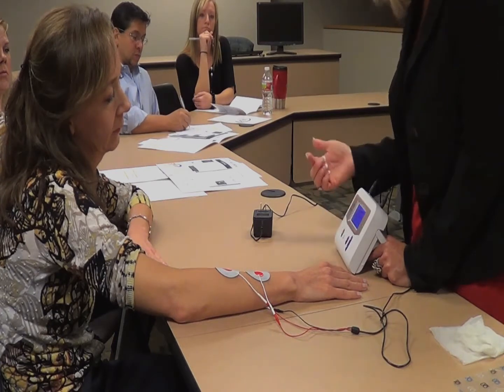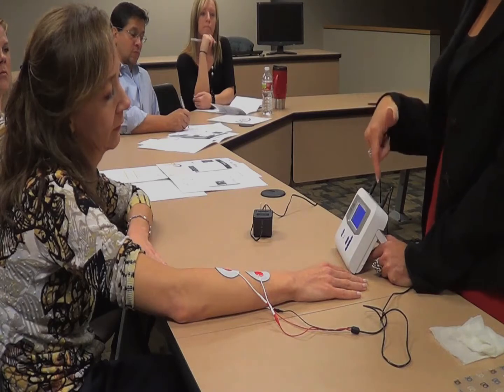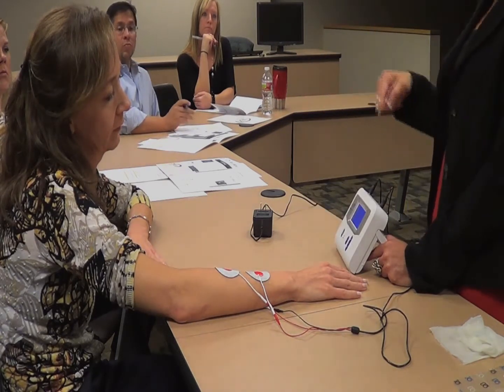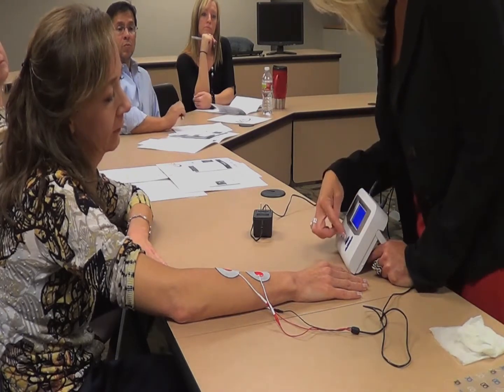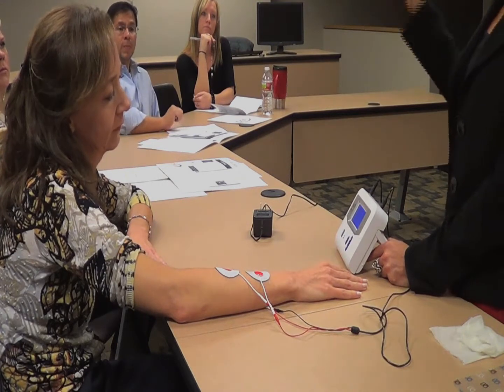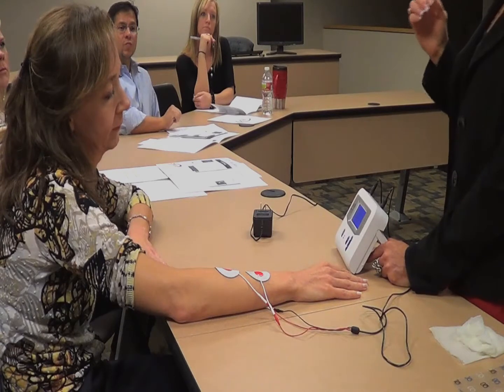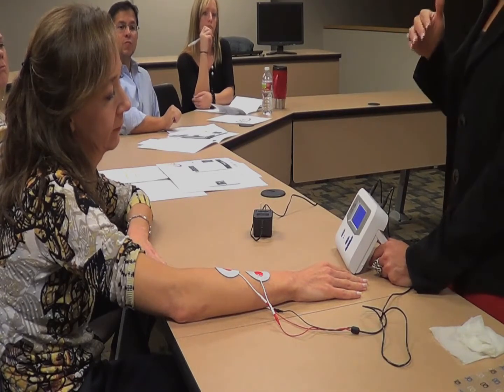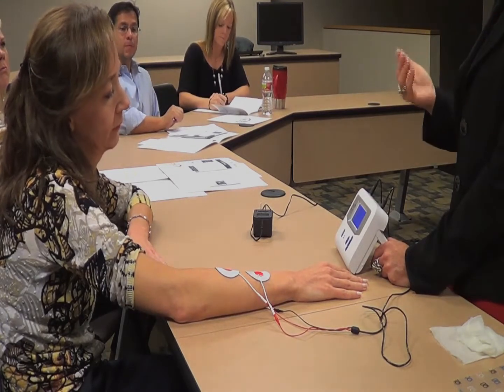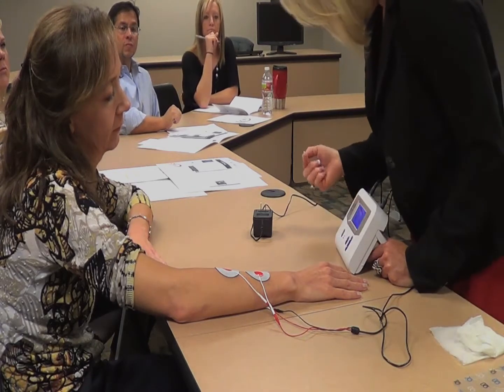And then if you hit it one more time, if you had changed anything, that gives you the factory defaults, and it's asking you, do you want to set the defaults? Showing you the arrow, that's where you would hit it, and then the defaults are set, and it tells you defaults are set. Then you hit the program again, and it takes you next. You're kind of out of that parameter loop, and it tells you how much battery you have. You need to be at 80% or above. So if you're at 80% or below, it's not going to have enough to do the program for you, so you need to plug it in. But it's at 99 right now.